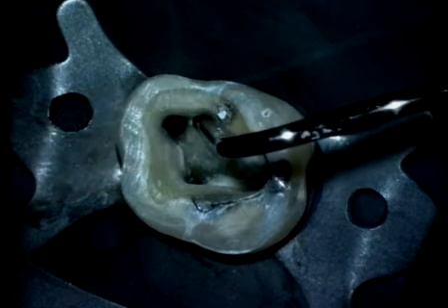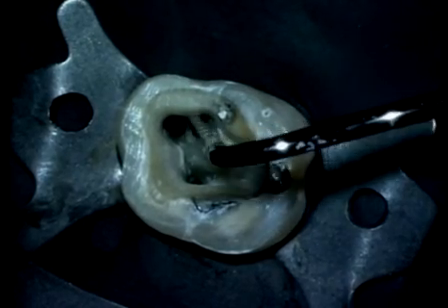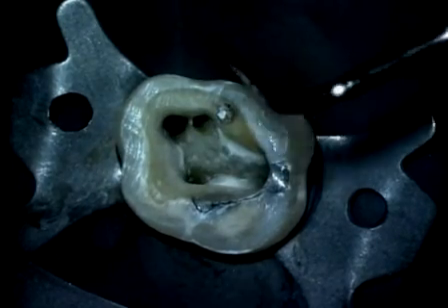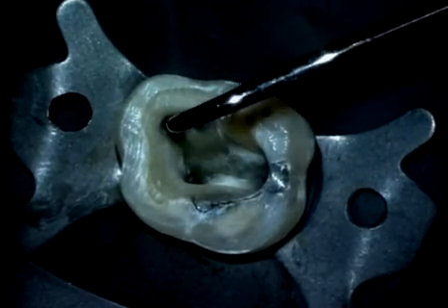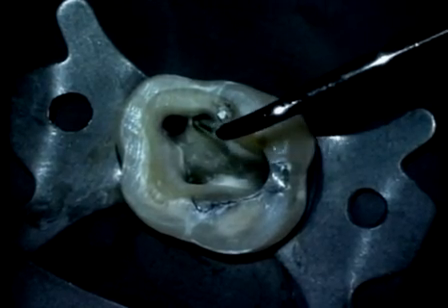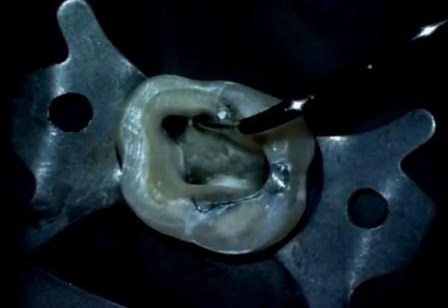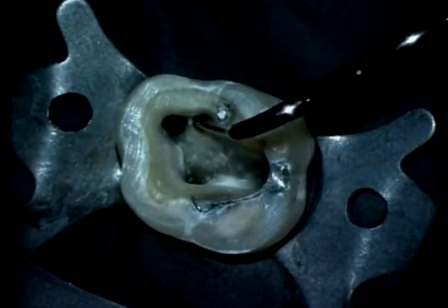The next procedural step is to pre-fit our pluggers. We select the largest plugger possible that fits passively in the coronal 1/3 of the root. Next, we select a smaller plugger whose cross-sectional diameter allows it to move deeper into the middle 1/3. We want these pluggers to work passively over a range of a few millimeters. Ultimately, we need to select a smaller plugger that will fit passively within 5 millimeters of the radiographic terminus.